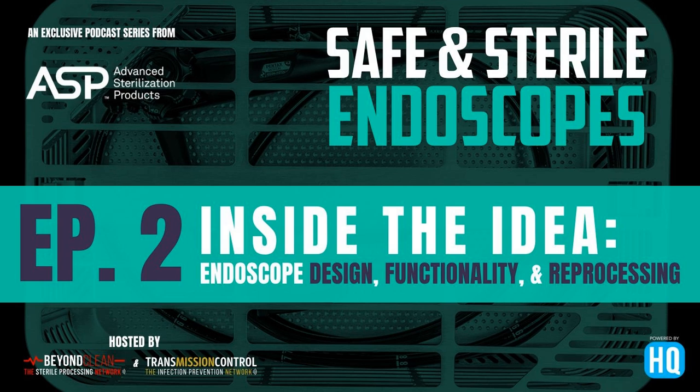Yeah. And Hank, something that's really important to note here is our audience may not know how long it takes for that process to happen. 2015 is when CRE had the big outbreak and was so popular with negative outcomes. And that's when the discussion started about how do we move from HLD to sterilization to increase that margin of safety. And it's taken this long to get somewhere. And the scope manufacturers, I can't speak for them, but they could have already been in process of trying to do that. So it does take a long time. It's not like I need it today and I'm going to get it tomorrow. It is years of science and research and development on both sides of the sterilizer as well as the device.